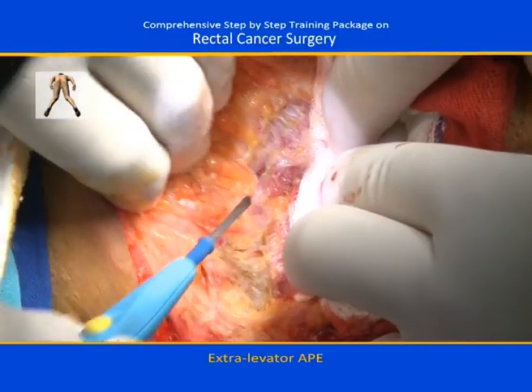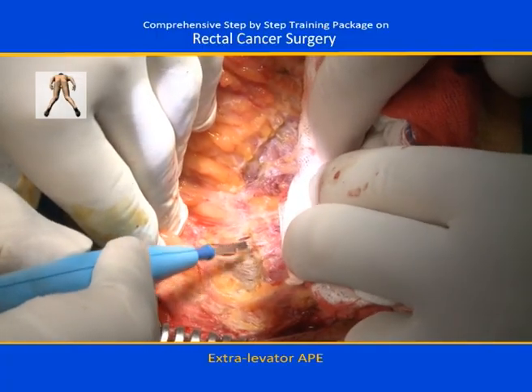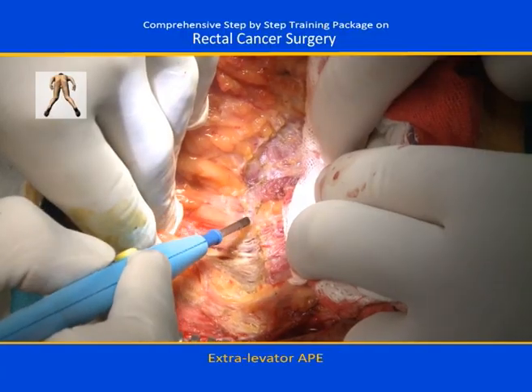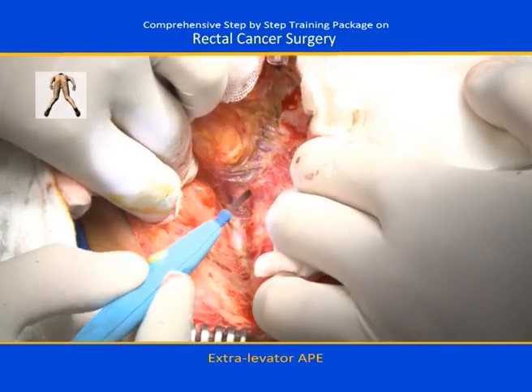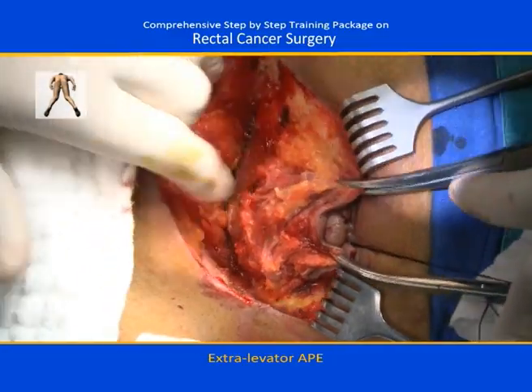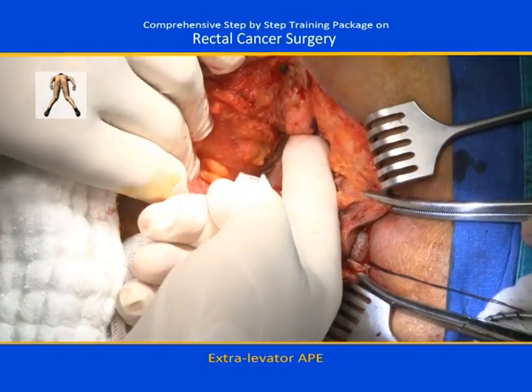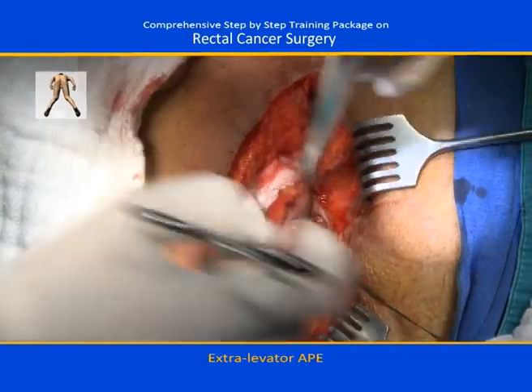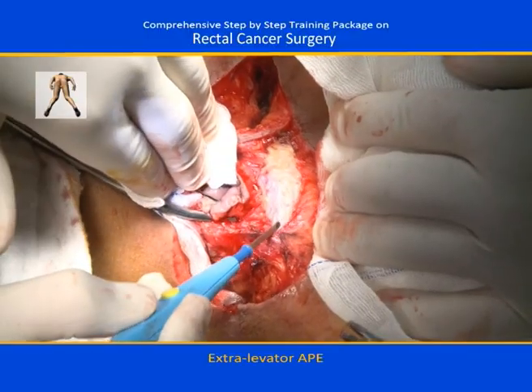Here, the perimuscular dissection plane is demonstrated in detail on another patient. The dissection is continued laterally within this perimuscular plane until the levator muscle reaches the lateral border of the pelvic floor, near their origin. As you can observe, the levator muscle is going to the lateral of the coccyx, passing under or in front of the coccyx. The same dissection plane is taken on the other side.